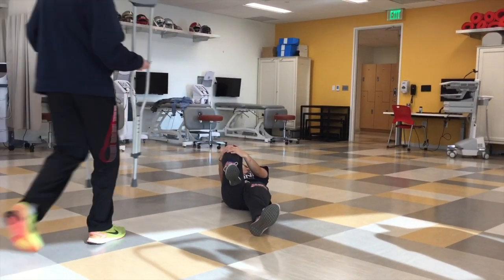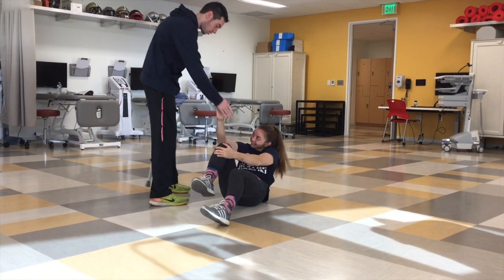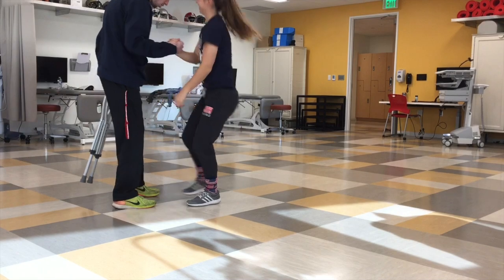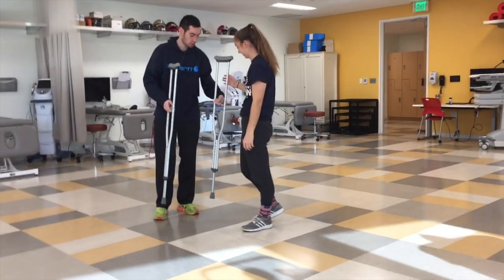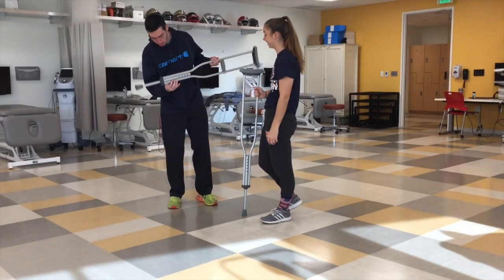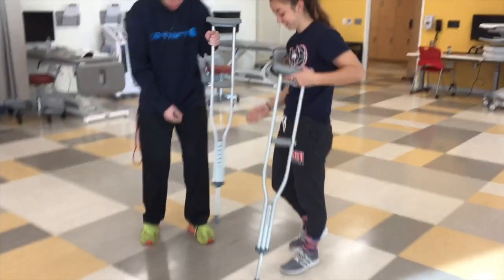Hey, I'm now an athletic trainer. You need some crutches. Keep your shoes on. Let's get up now. Alright, how tall are you? 5'6". Here, can you hold this? Oh wow, what a coincidence — this one's 5'6".